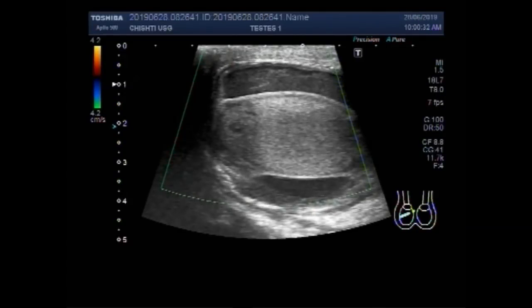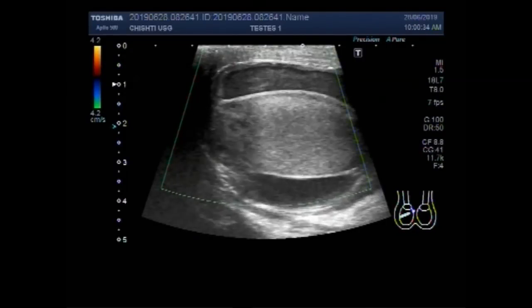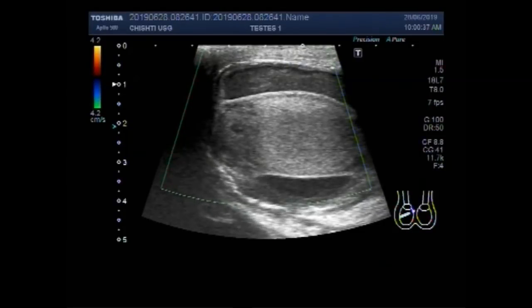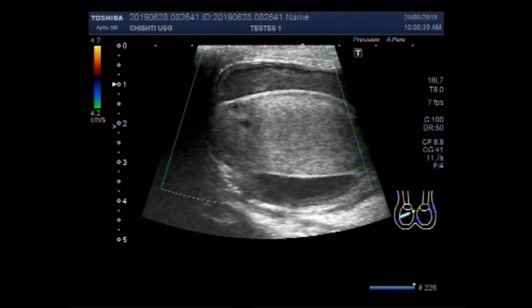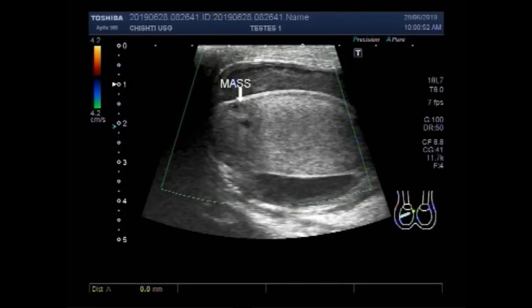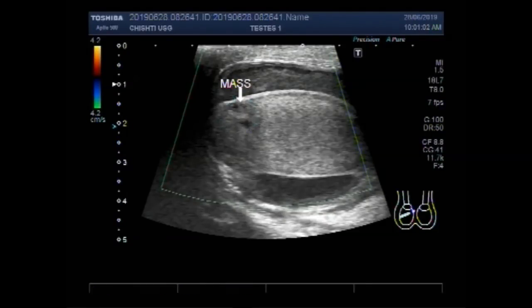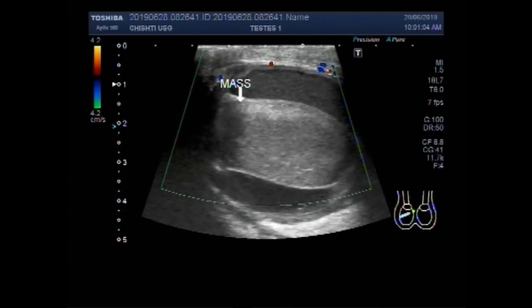Now you can see a small mass in the medial side of the testes. This is a heterogeneous area — an echogenic area with heterogeneous echogenicity — and it measures about 10.0 mm by 8.6 mm.